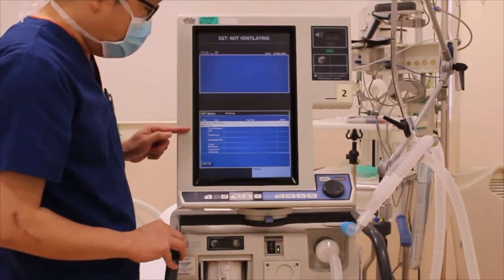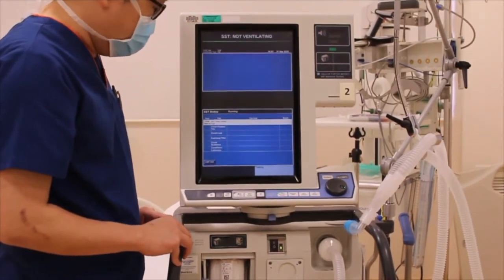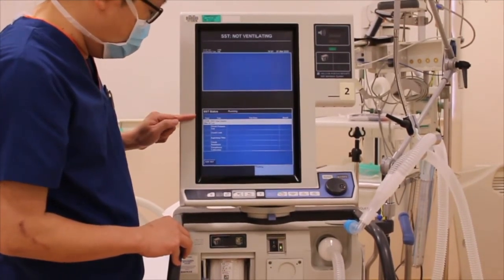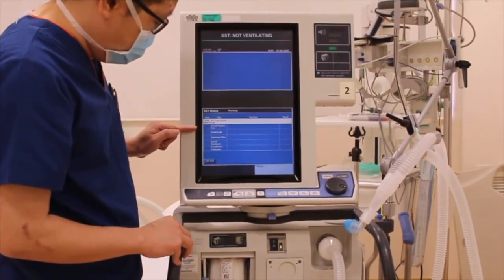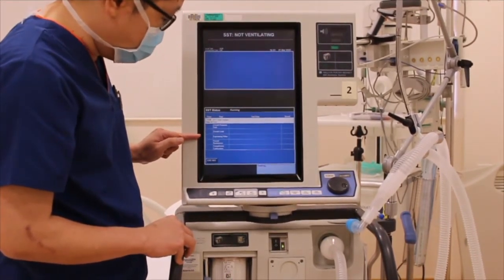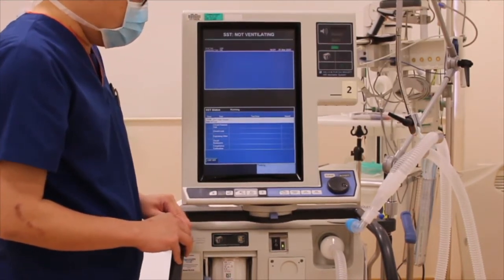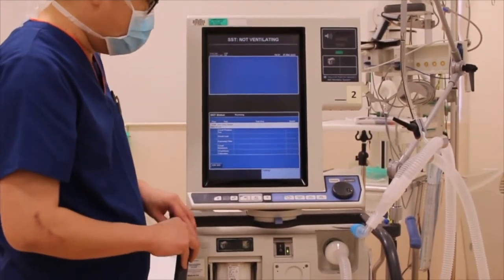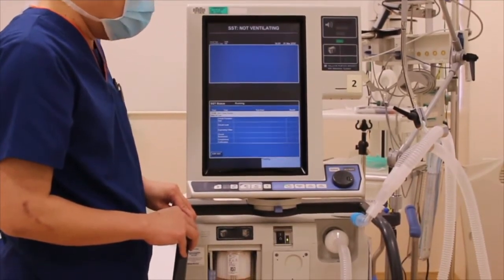The whole process of the SST will take about 5 minutes to complete. During this process, it will do multiple steps to check the sensor, the circuit pressure, the presence of any circuit leak, checking the health status of the expiratory filter, as well as calibrating the circuit with resistance and compliance in the last few stages. As the process continues, you will hear a lot of noise as well as pressure changes occurring from the ventilator — this is normal, do not be alarmed.